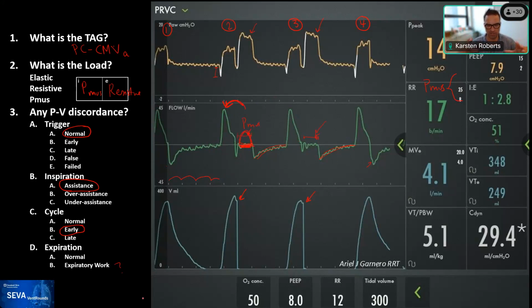There's this pressure gradient that somehow meets equally in the airway and the pressure of the alveoli, and that stops the flow. But you're pointing out that different ventilators have different ways of reacting to this, right?